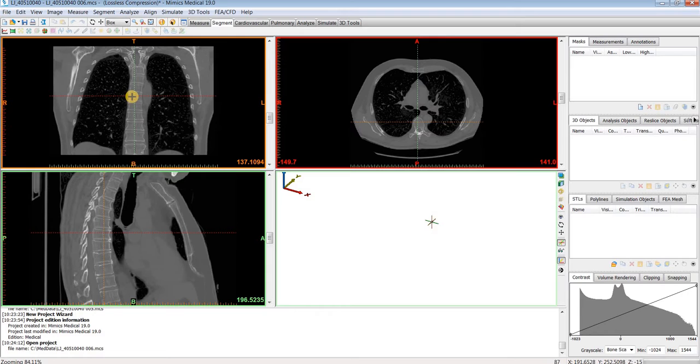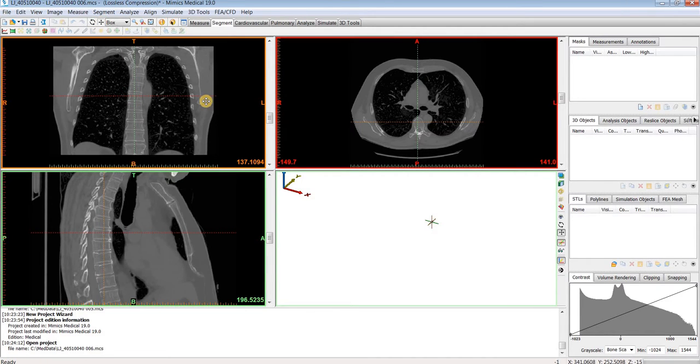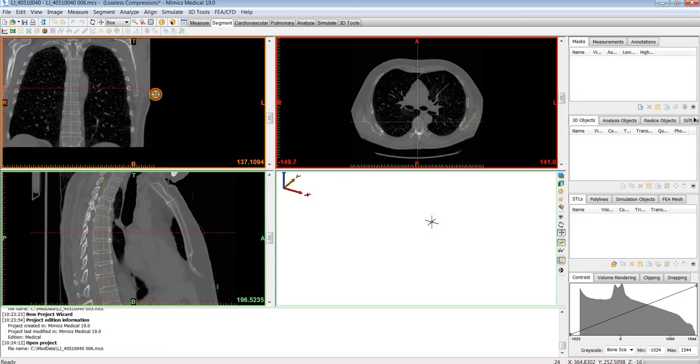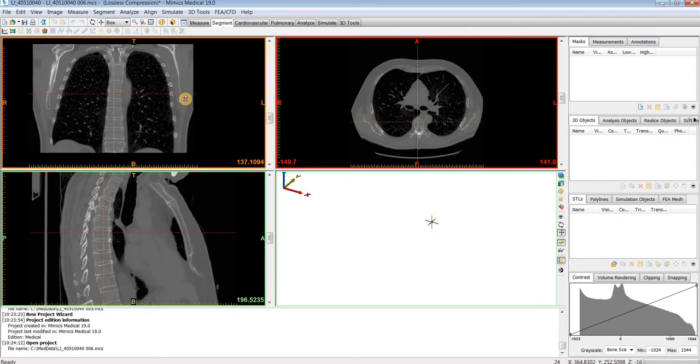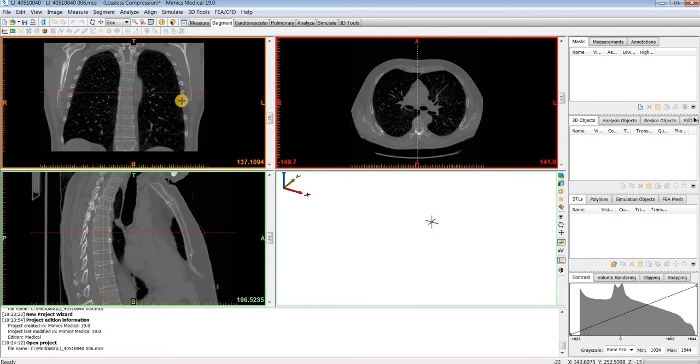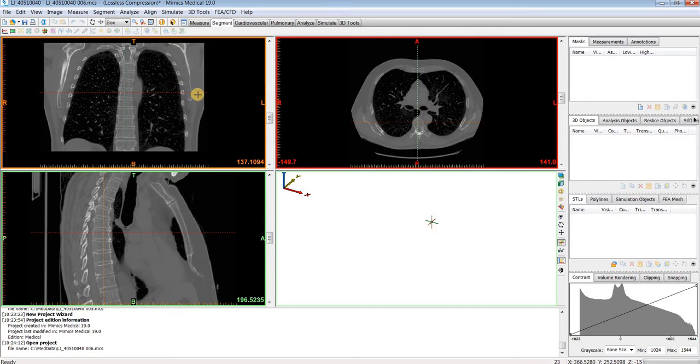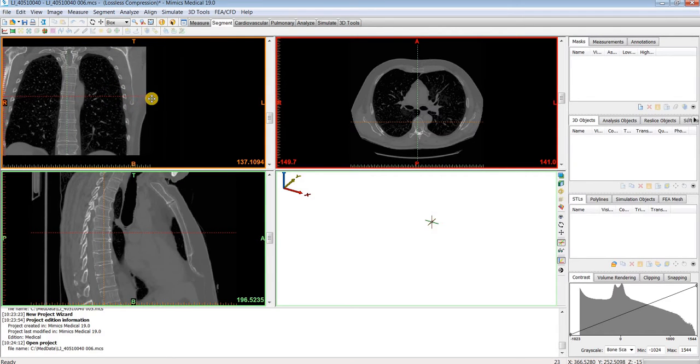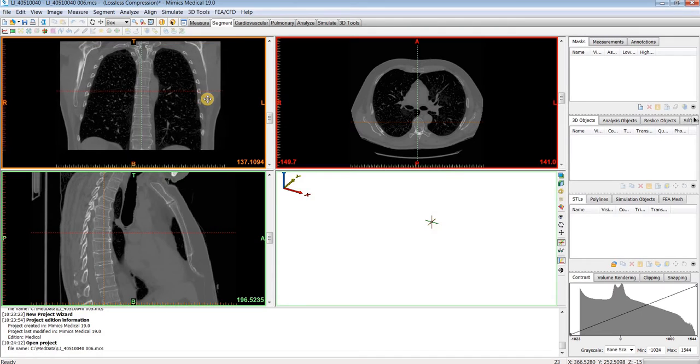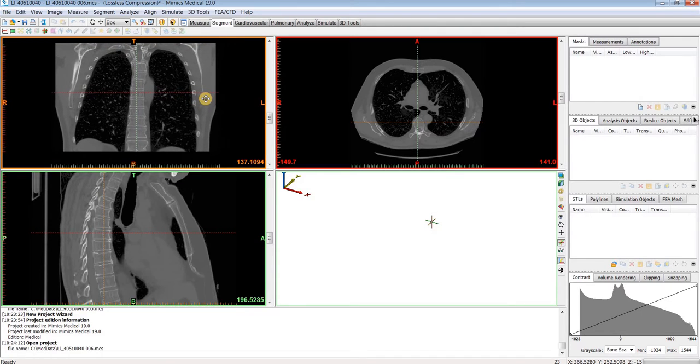To pan your windows, you can select this pan button here and then hold down left click and drag your mouse around. Or for the shortcut, if you have a scroll wheel on your mouse, you can push in that scroll wheel and drag your mouse around to pan around in the images.